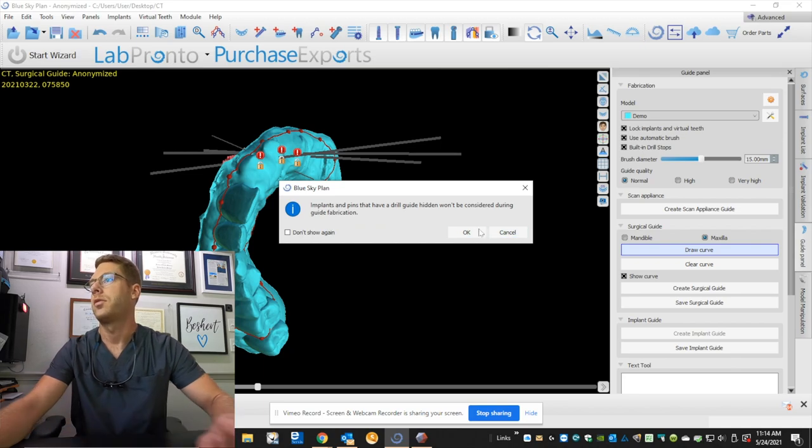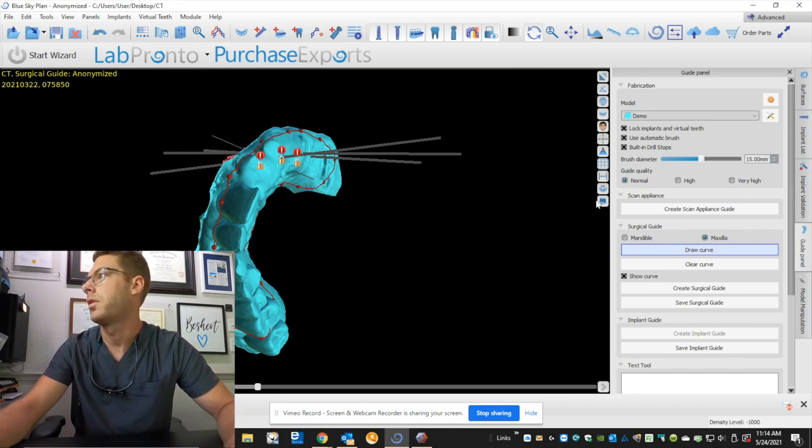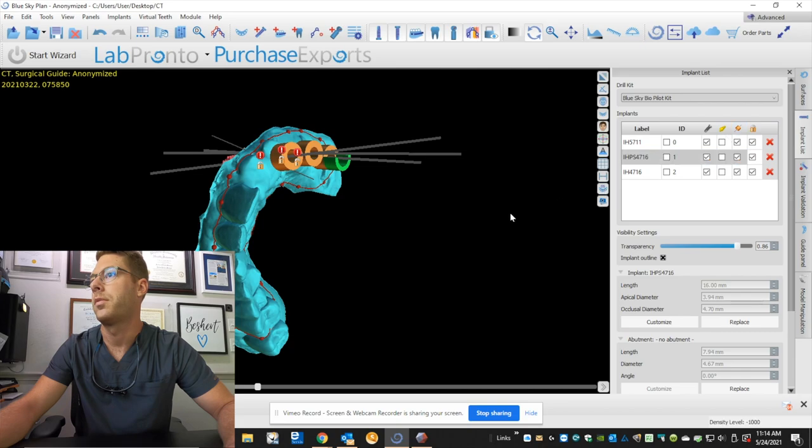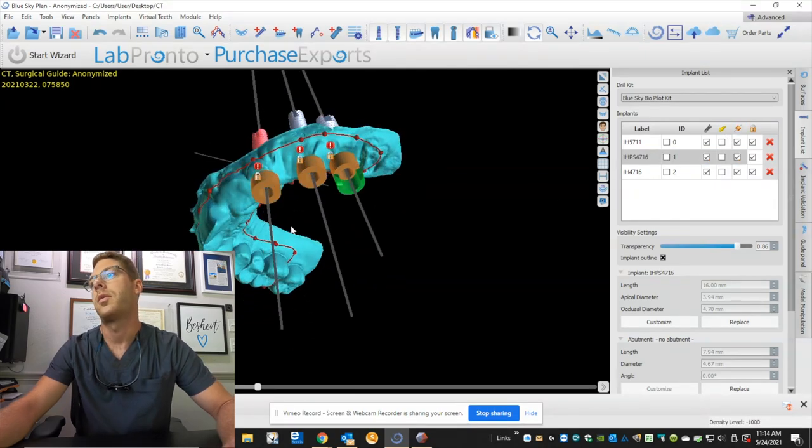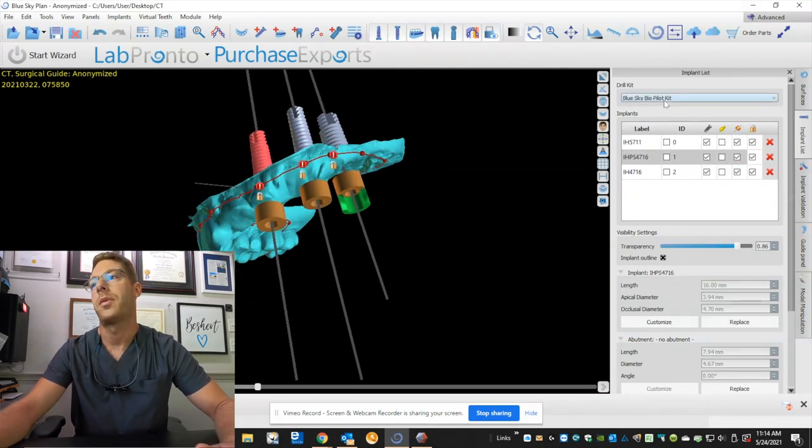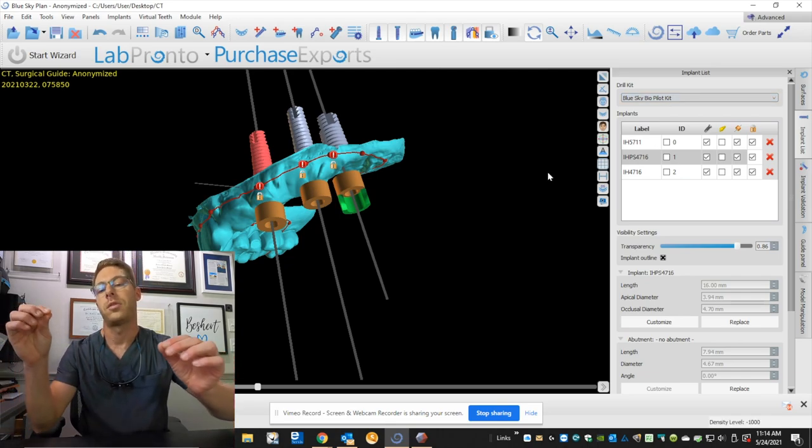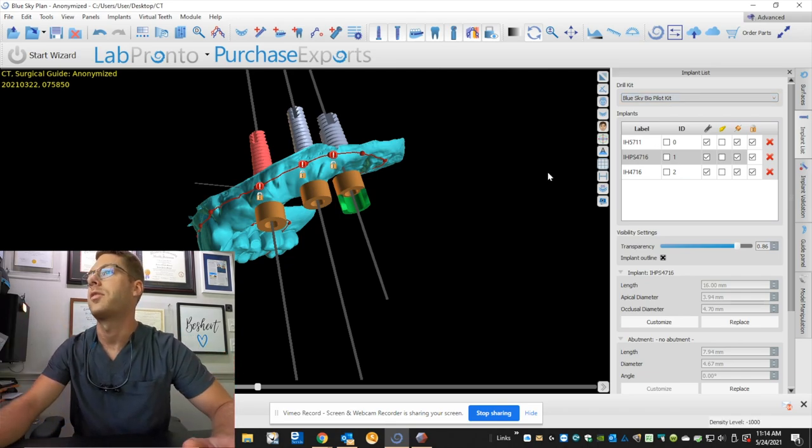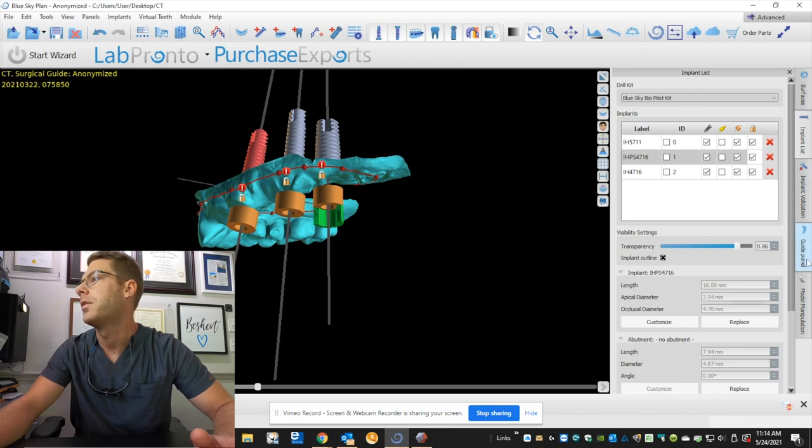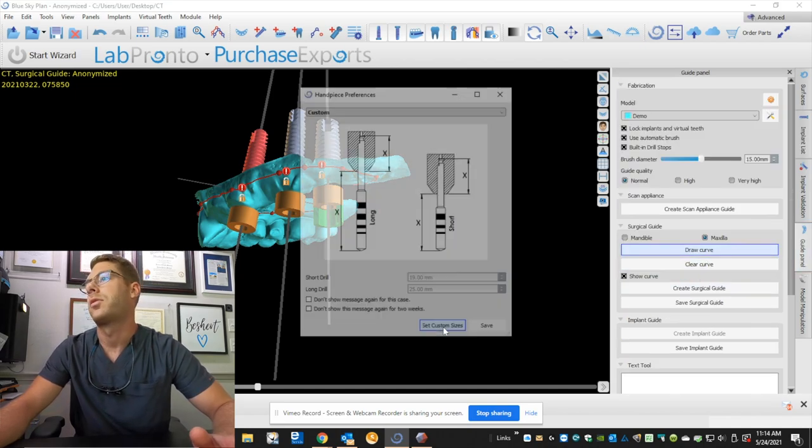Okay, so it's telling me that my drill guides are hidden. So I need to open those up. There we go. And so these automatically set my drill guides from my Blue Sky Bio Pilot Kit. So that way, when I insert the pilot drill, it goes exactly the depth, direction, and angle that I want. And let's create our surgical guide.